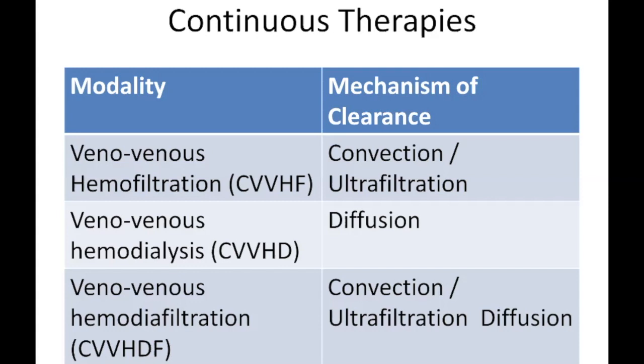If you do that enough times over a long enough period of time, you'll replace most of the dirty plasma water with clean IV fluids, and all the good stuff will still be in there. No change in the red cell count.